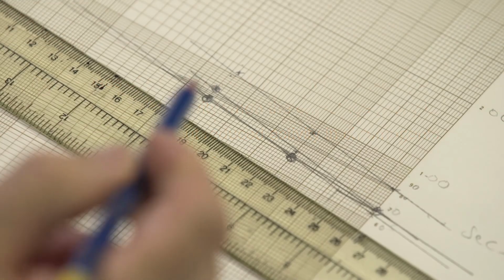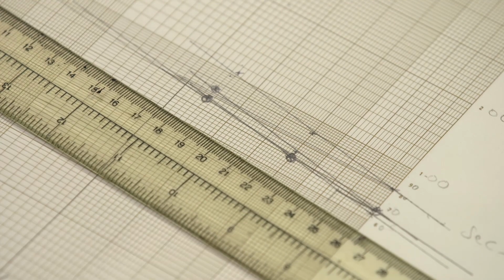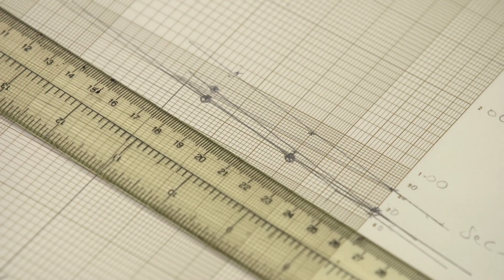It's also, I think, an illustration of why we must be really careful in our assay design and why we should not use a single test dilution. Let's suppose we'd made just a single test dilution, the 1 in 10. That would be the normal practice in centres doing a single test dilution. Remember, the clotting time was 67 seconds.